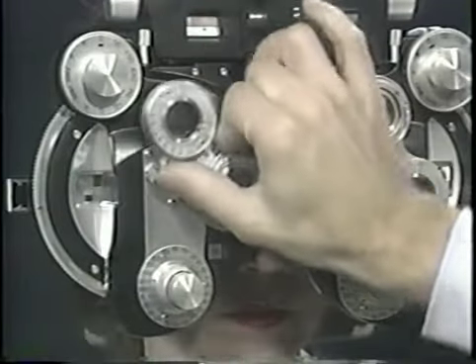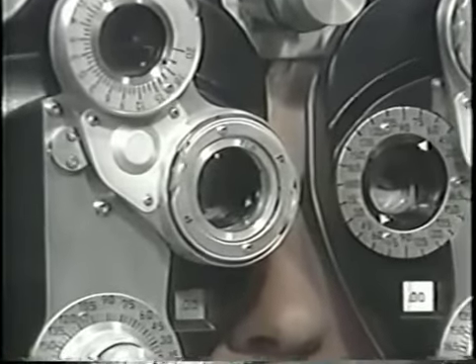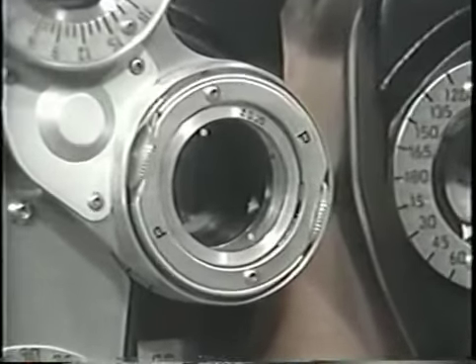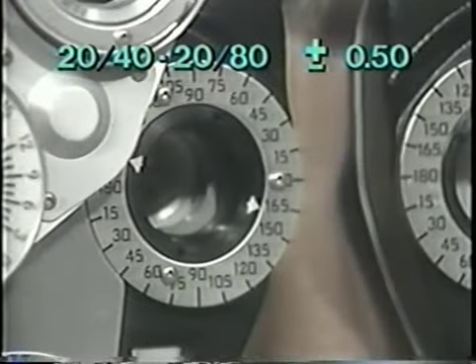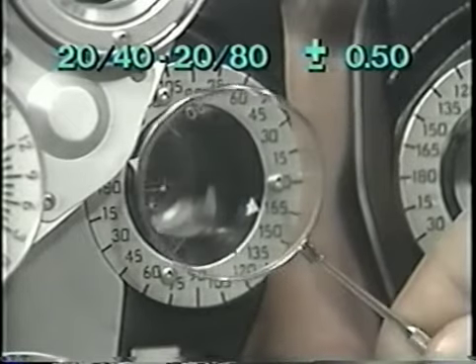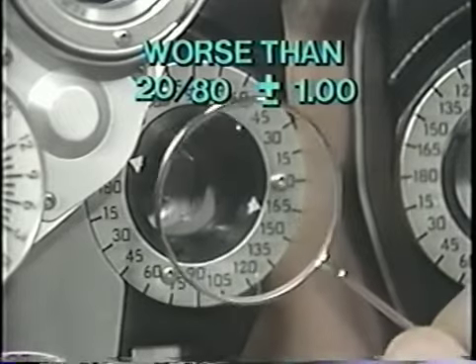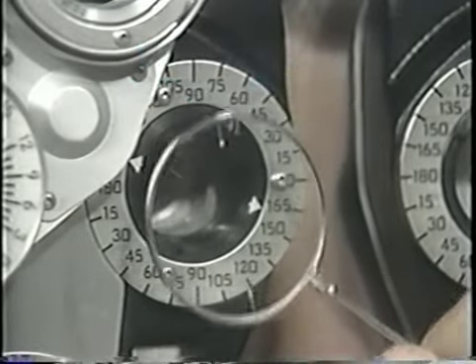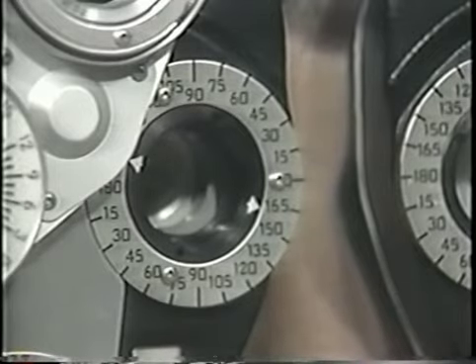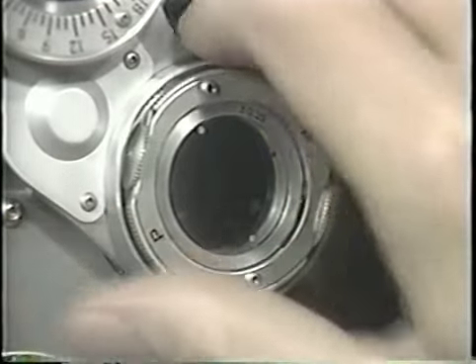Cross-cylinder testing comes next. The cross cylinder on this Reichert phoropter is a quarter diopter cross cylinder, the one most commonly used when visual acuity is 20/30 or better. If visual acuity is between 20/40 and 20/80, however, a handheld half diopter cross cylinder should be used. With vision worse than 20/80, a handheld 1 diopter cross cylinder may be necessary. Again, the change must be great enough for the patient to detect. As vision improves during the refraction, the lower power cross cylinder should be used for greater sensitivity.